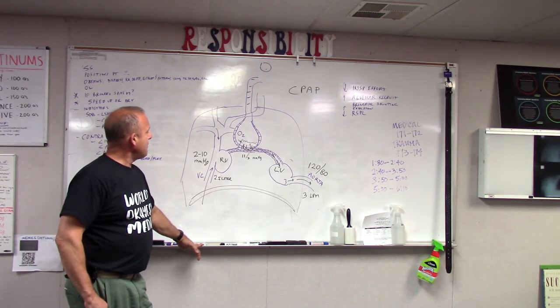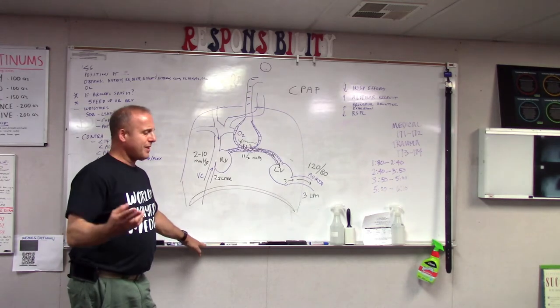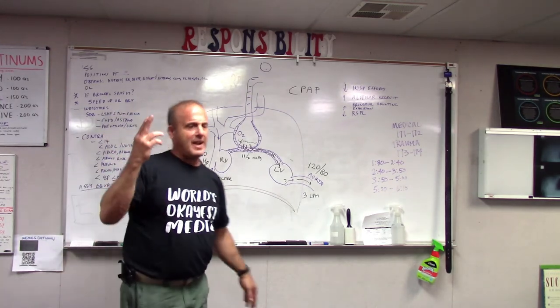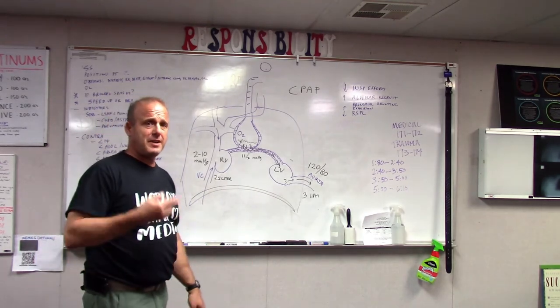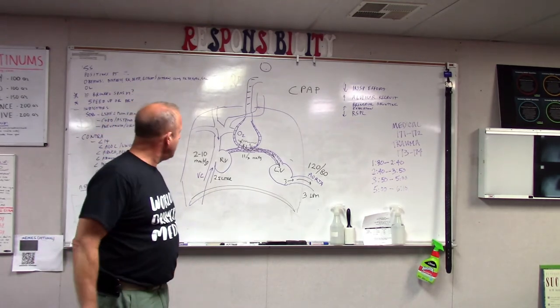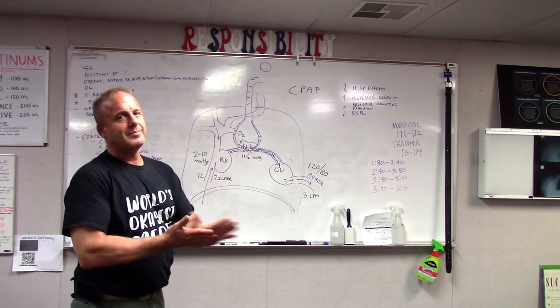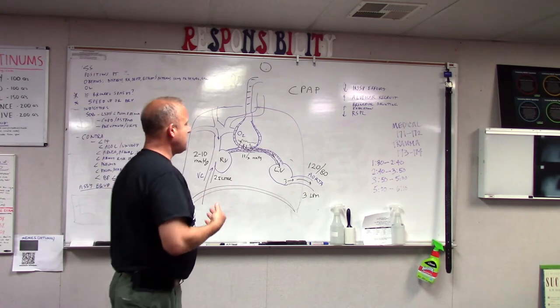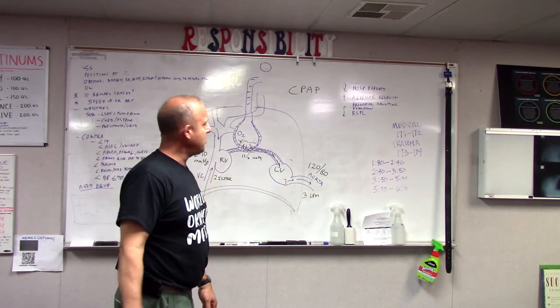So how else can we reduce venous return to the heart? Because nitro sometimes doesn't work. Maybe tricky, the person just took Viagra, can't give nitro. They have a combination right-sided failure as well as left-sided failure, oh crap. What else can we do? We apply CPAP. Magic. You can do it with BiPAP as well, but CPAP is what we carry because it's mechanically way easier.